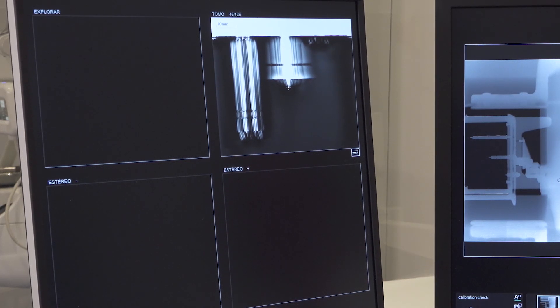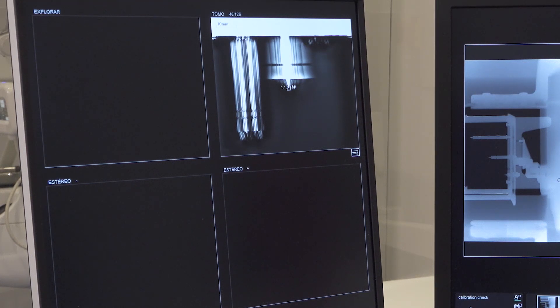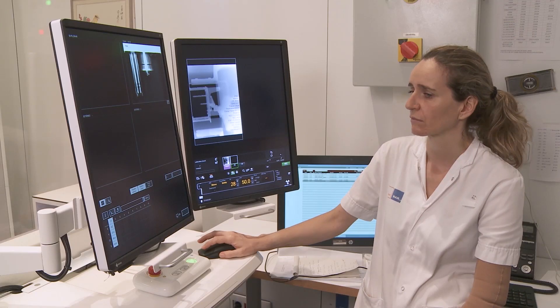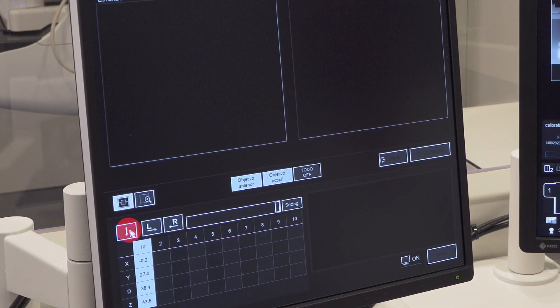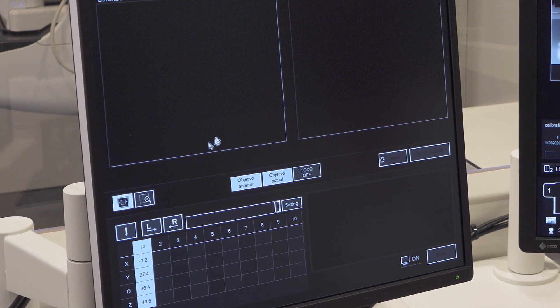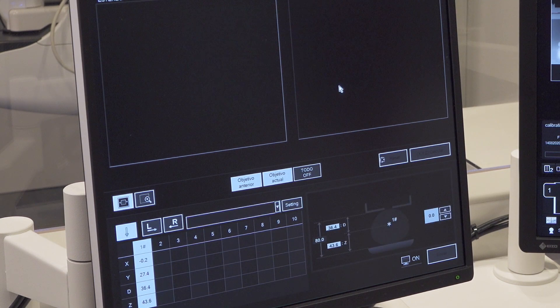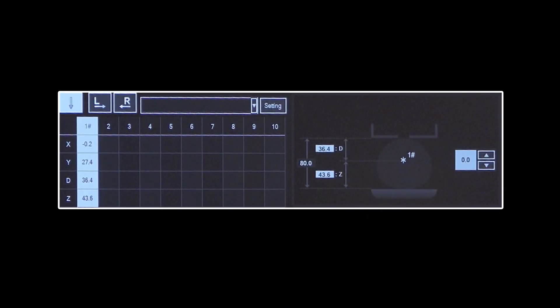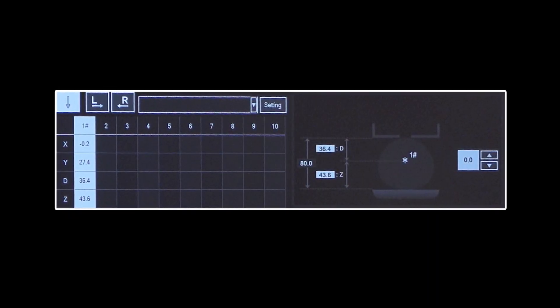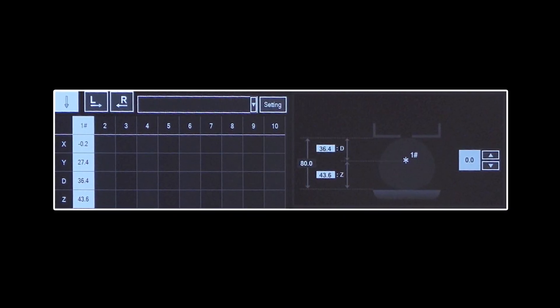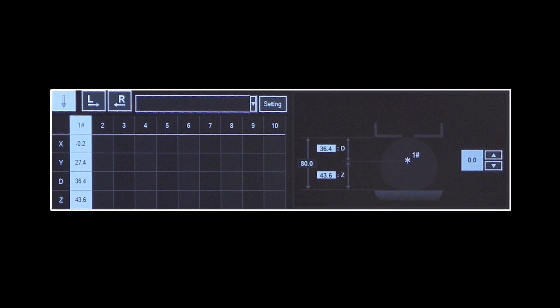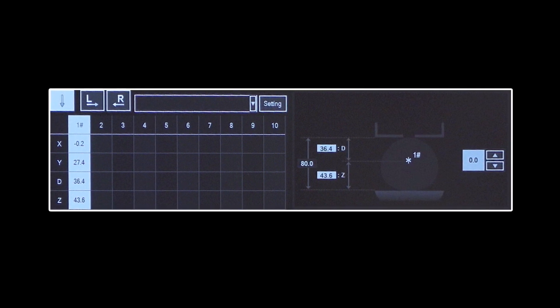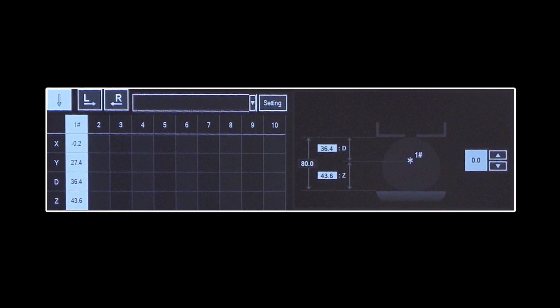Place the marker on the target. Select vertical approach. Observe the breast pictogram indications: breast thickness, target distance to breast support and skin, as well as the target coordinates X, Y and Z.